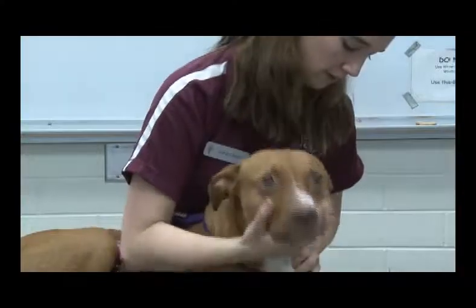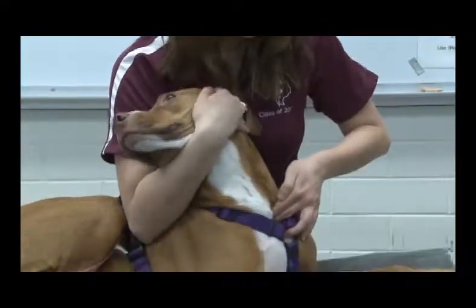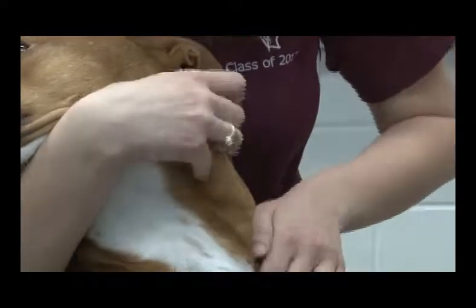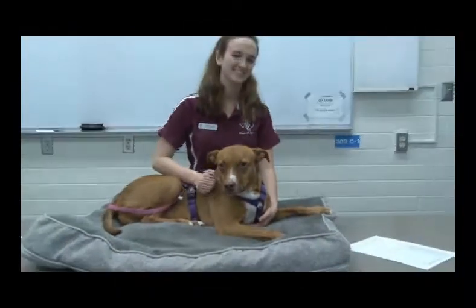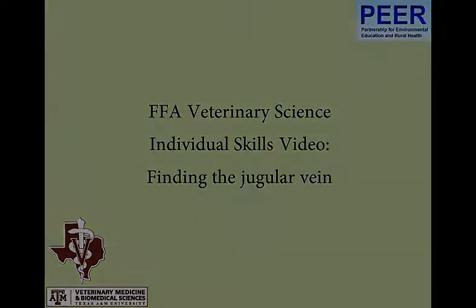Put your fingers at the thoracic inlet and then push in and up. You should start to see the jugular vein pop up. In a veterinary clinic you'd have their neck shaved, so it would be a lot easier to see. And that's how you get the jugular vein.